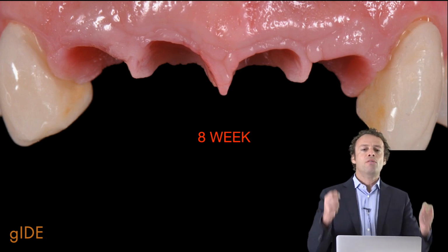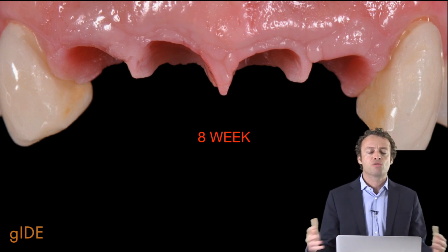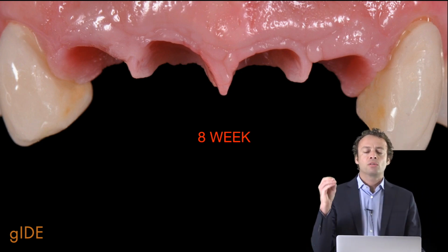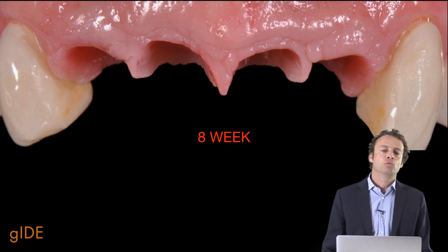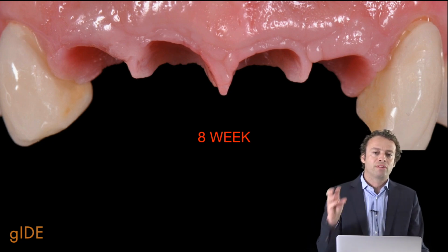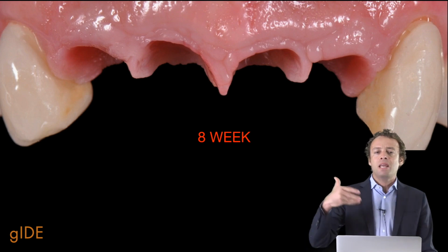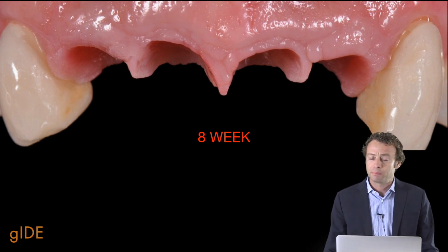So it means that when I remove the temporary and wait 5 minutes, the soft tissue morphology will have changed if I take another picture. So it's important, also in this situation, to find a solution in order to be able to transfer to the lab this kind of situation, the situation that we have tested in the mouth and have created over many weeks of treatment in our clinic.